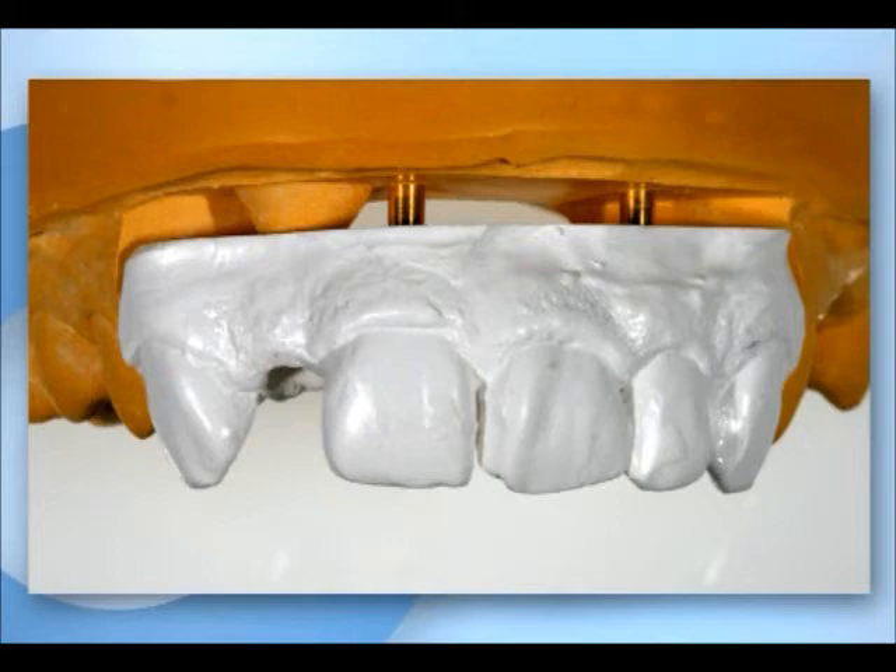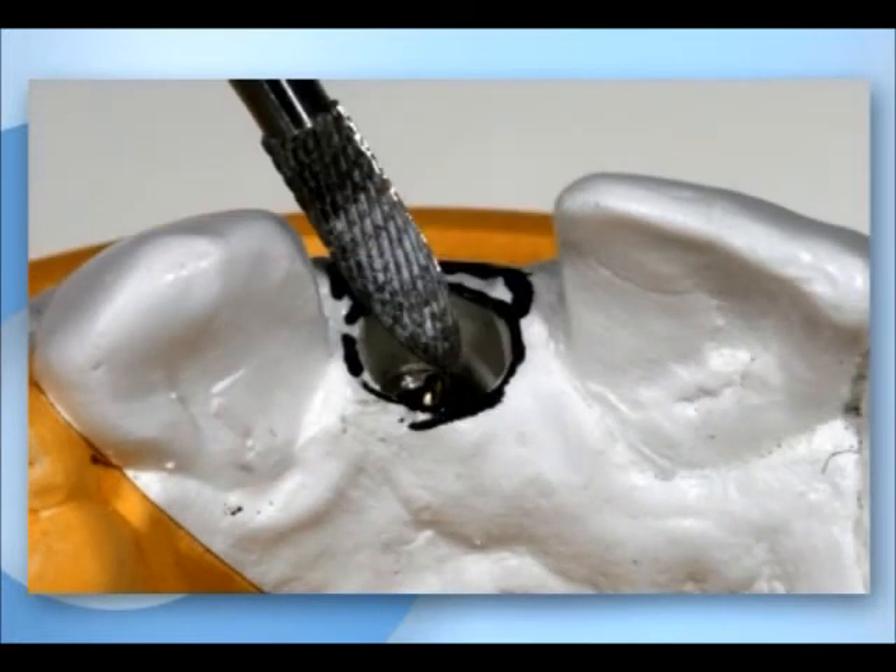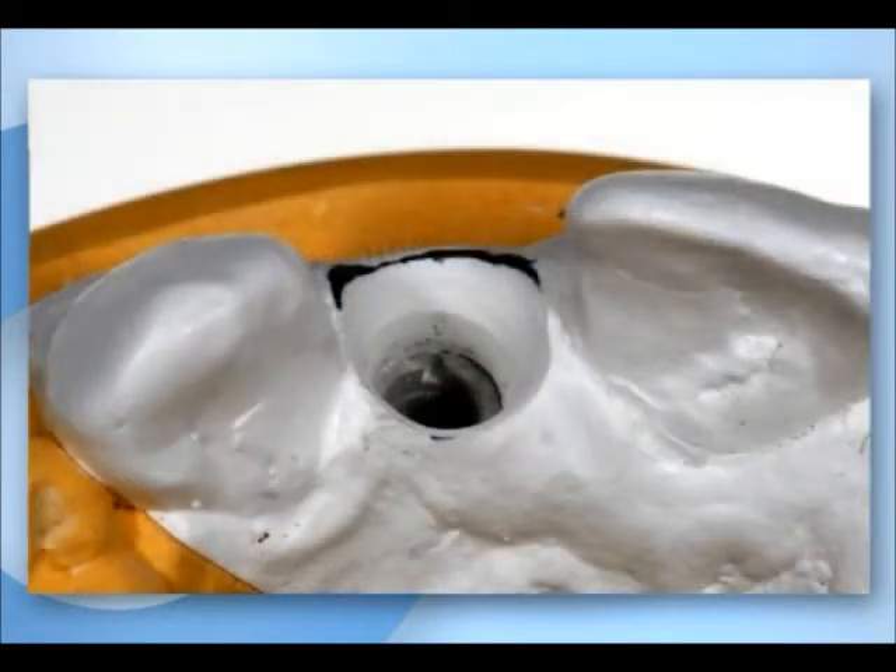The detailed structures are important when creating an implant crown. For an optimal contour of the soft tissue, the emergence profile has to be formed. It is important to define the appropriate dimensions in the oral-vestibular and mesiodistal directions. The emergence profile around the lab analog is made by the lab technician using a fine milling tool.